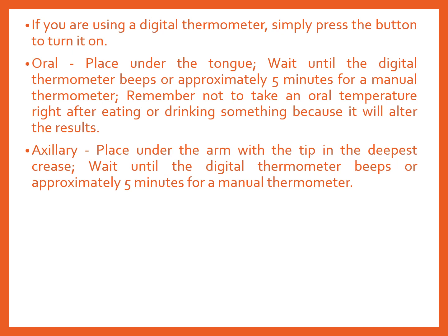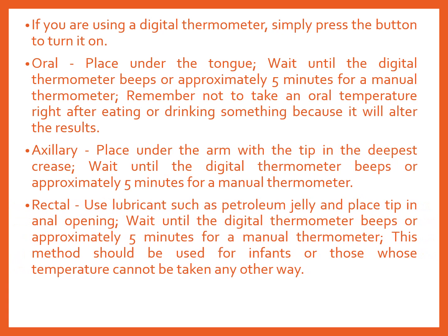Axillary, or your underarm: place the tip under the arm at the deepest crease. Wait until the digital thermometer beeps, or approximately 5 minutes for a manual thermometer or the mercury-in-glass thermometer.